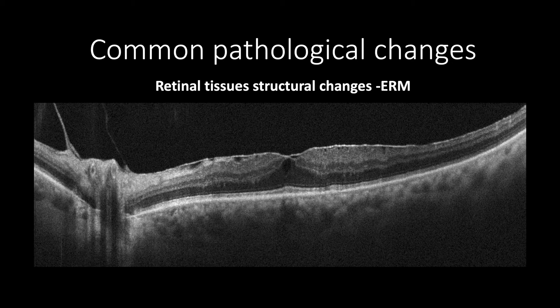This cross-section shows the epiretinal membrane appearing as a hyper-reflective membrane causing corrugated inner retinal layers forming peaks, along with intra-retinal cystic formation and disruption of the ellipsoid zone and increasing of retinal thickness.